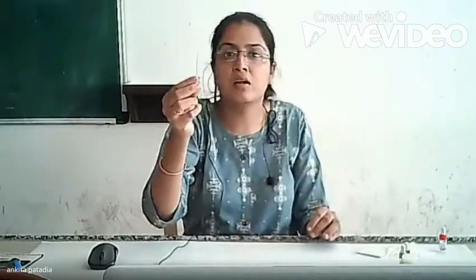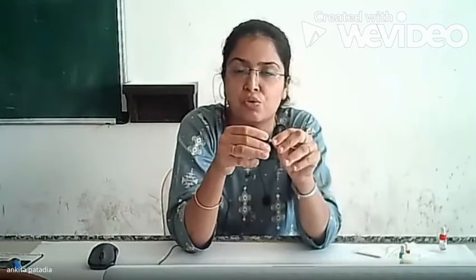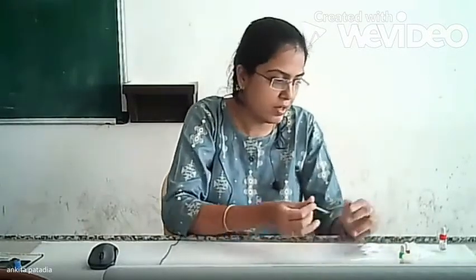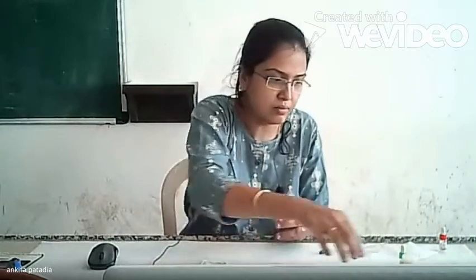This is the disposable dispenser with the kit or rubber cork. You can remove rubber cork after each use and use new stick, new dispenser. This is the disposable stick for the mixing. Now we are placing 1 drop of positive control in marked area.